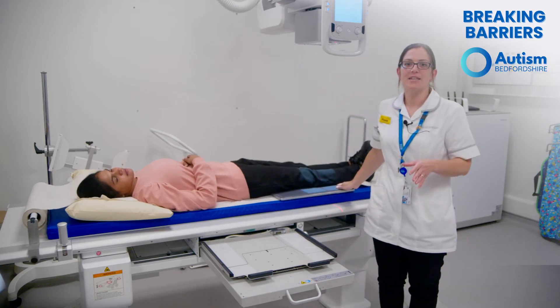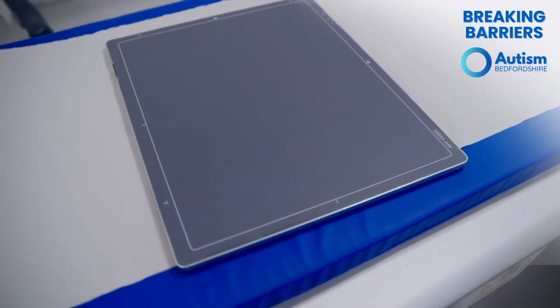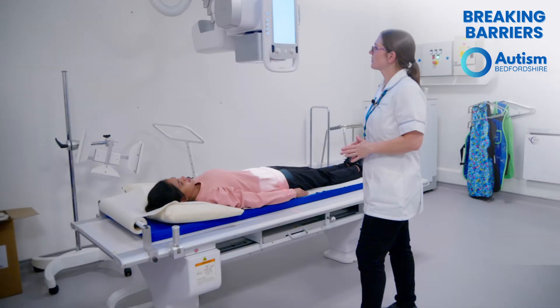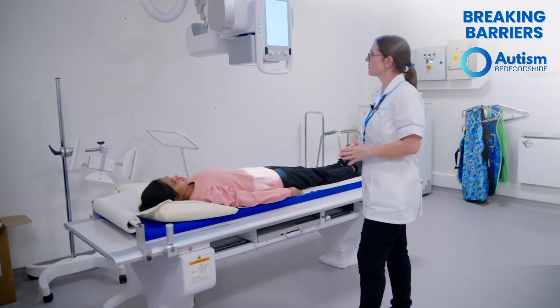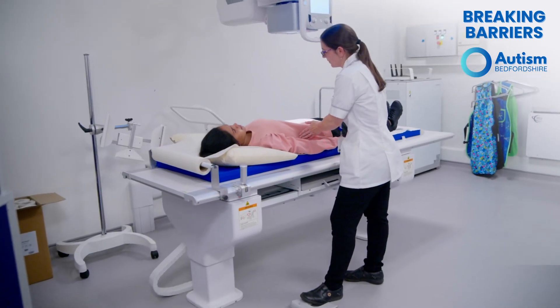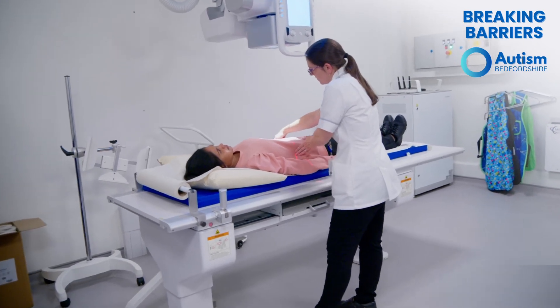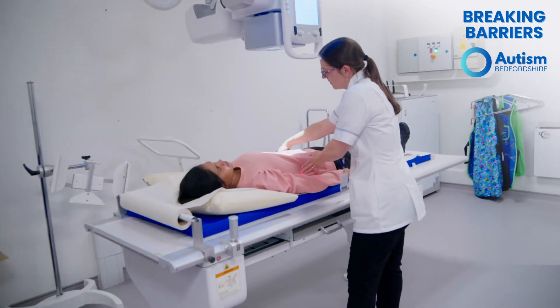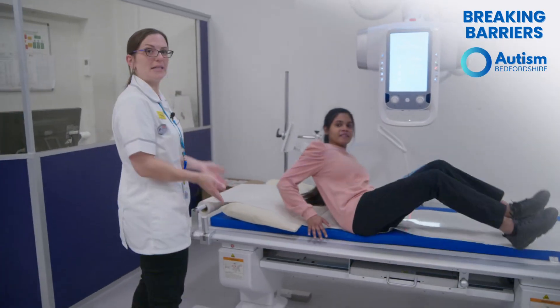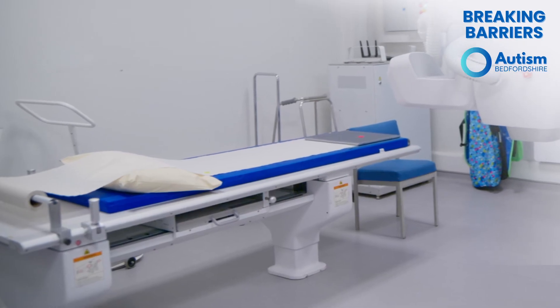The detector and all the equipment can feel quite cold to touch, because it doesn't work as well if it gets warmer. The x-ray bed can move up and down and side to side. There will usually be paper on the x-ray bed to help keep it clean, which is put into the bin after each patient and replaced with fresh paper. Please do not worry if the paper moves or rips — it is not a problem at all.